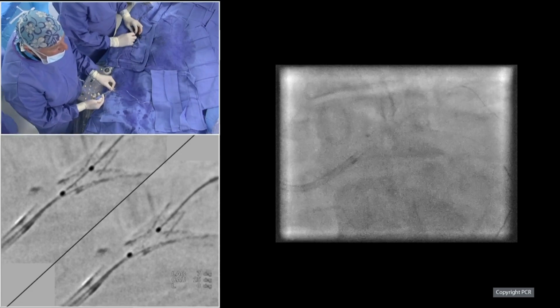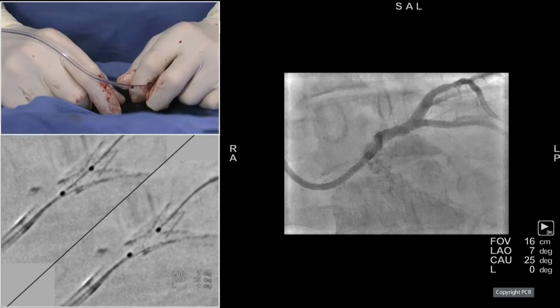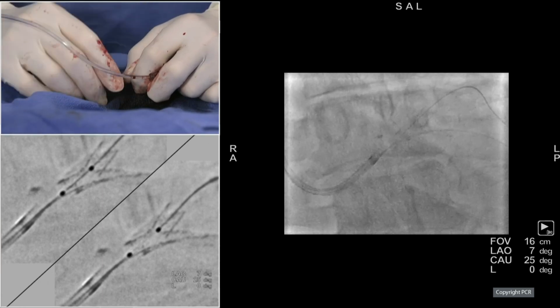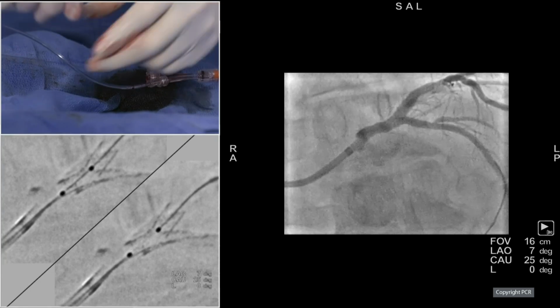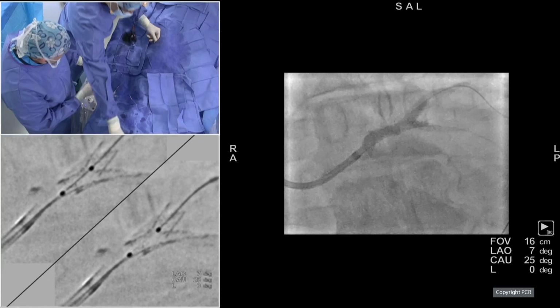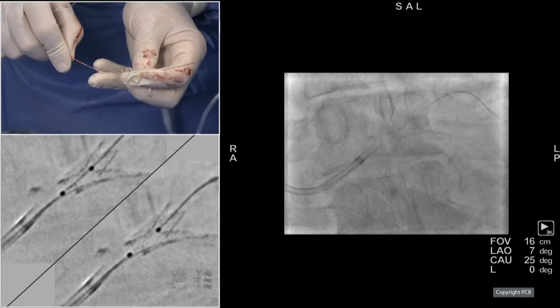Jean, what do you think happens there? Is that something which has moved forward, or is that something that has been shortening, pushing one metal into the other? Because the picture of the StentVis is very clear. Yeah, but I think it's a little bit of shortening, because we could see a more dense image of the stent proximal to the carina, and this is certainly the double layers of the stent.